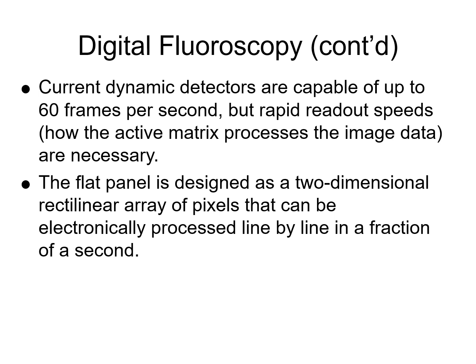All right, so the dynamic detector, nothing's changed about the technology of how it captures the X-ray. What is changed, and what I said on the previous slide, is how fast it can rapidly read out a set of full pixels. So we shower the detector with X-ray photons, and then dependent upon whether it's direct or indirect, those are converted to light or are absorbed directly. And what ends up is, just like the CCD, storing boluses of positive charge on individual capacitors for individual picture elements, okay? But when we beef up the readout electronics, we can actually take a new picture with a dynamic detector system 60 times a second.